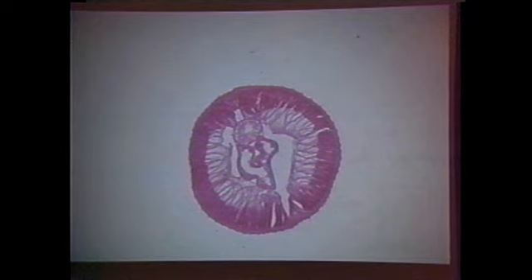Well, a cross-section of a worm is going to be round to oval, right? We're going to cut it across this way. Nematodes are elongate and pointed on each end. Now, if you look at cross-sections, and when you're describing a worm, try to get the one that is the most cross-section if you can. You'll want to look at a cross-section.